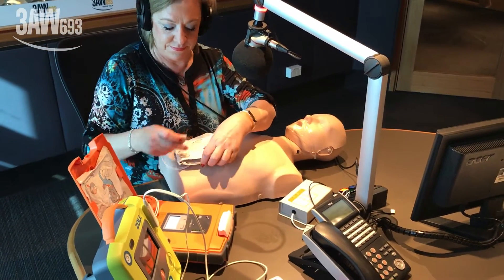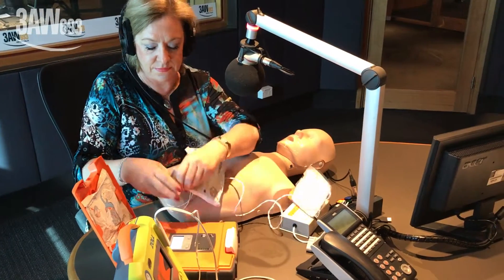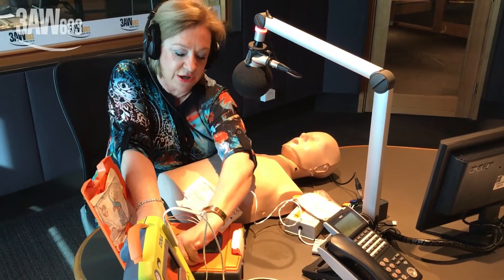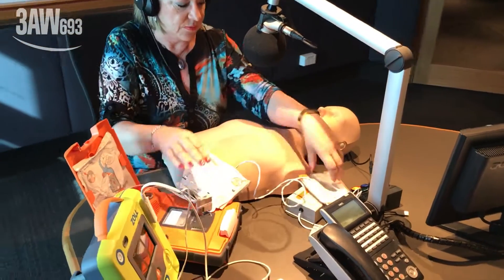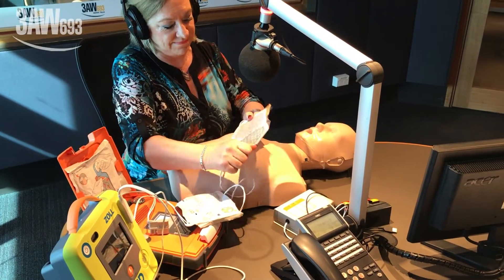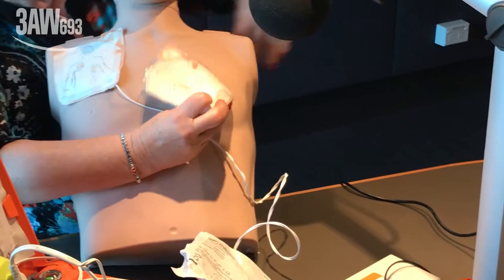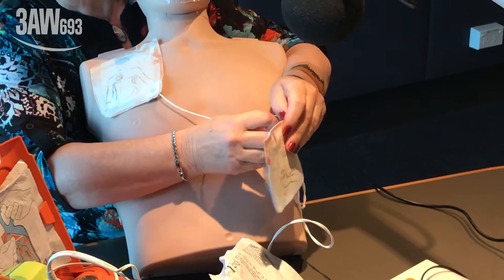That's so easy so far. The device says: 'Peel one of the white pads completely from the blue plastic, beginning from the tabbed corner. Make sure the pad connector is plugged. Firmly place the pad without the blue plastic on the patient's bare chest.' The pad is stuck on his chest — he must wax, there's no hair there.